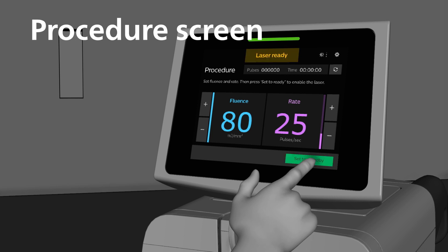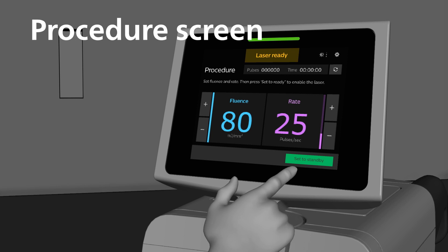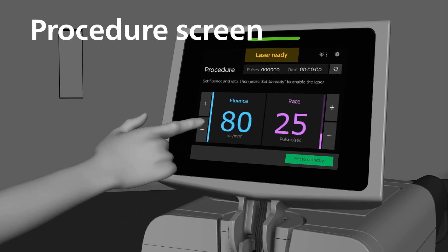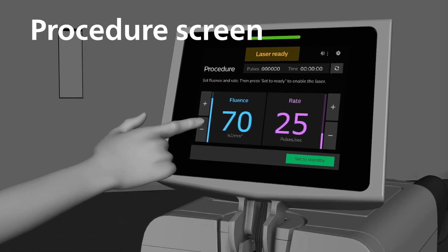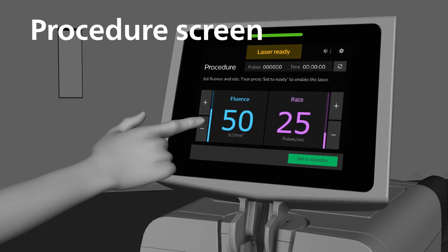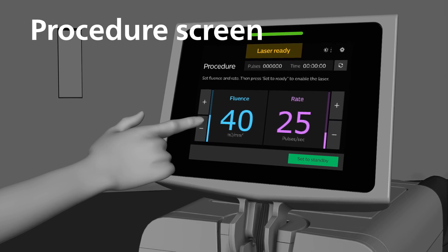Pressing the Set to Ready button places the system in Ready mode. If the system has not been calibrated, the system cannot enter the procedure screen. Fluence and Rate settings are adjustable based on procedural need and physician's discretion. To adjust settings during the procedure, please use the interface of the procedure screen.